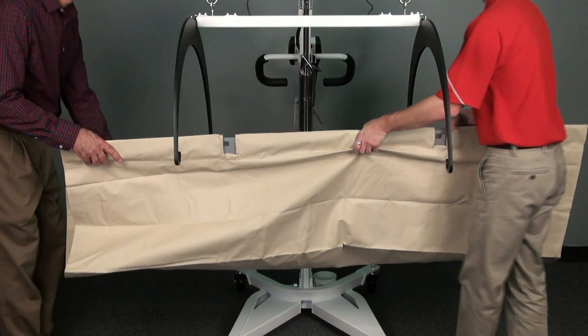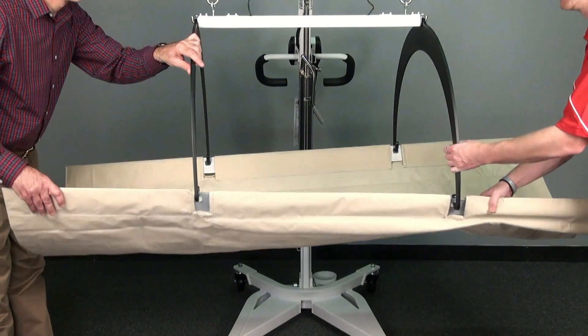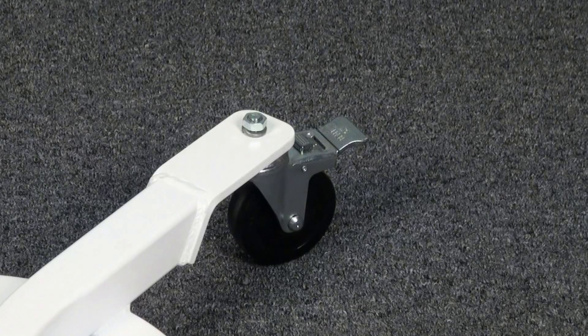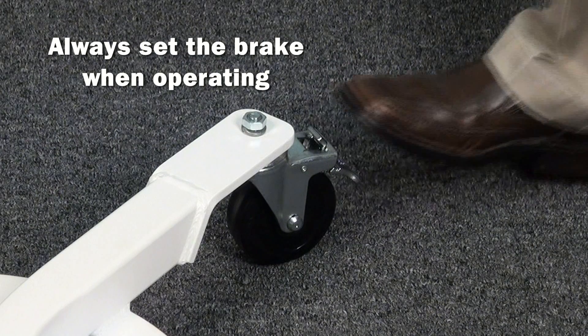For operation, the red anti-swing bars should be removed and the stretcher attached to the support hoops by inserting the hooked ends through the four holes in the stretcher support bars. Remember to always set the wheel brakes when operating the IBFL 500 in-bed scale.